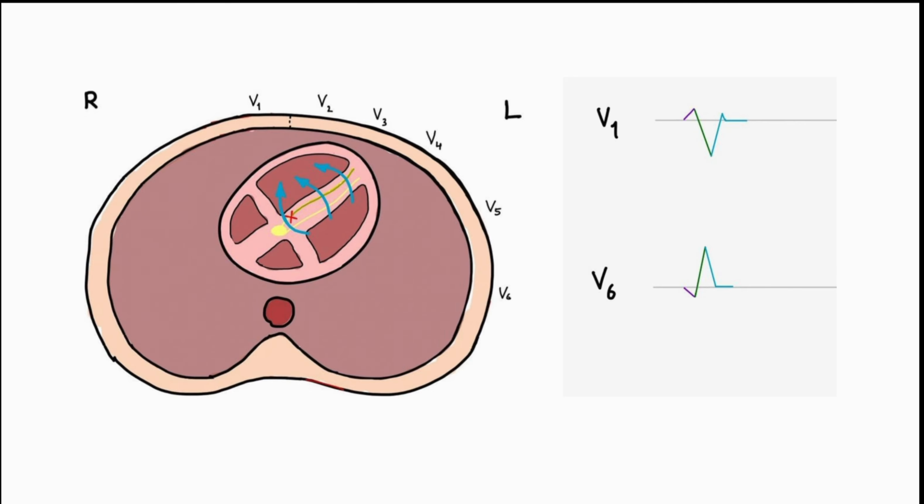So that's positive deflection towards V1 and that negative deflection towards V6. And the whole thing widens because it's taking longer because those are not specialized conducting fibers. Now, you might already be seeing that slight M in V1 and that slight W in V6, that much hated William Marrow. And there it is. Nothing magical, spelt out there step by step.